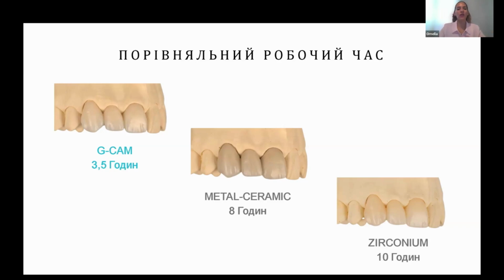We have to design. We are working in a monolithic way. This is going to help us go faster, but obviously zirconia needs hours of sintering process. We know that we need to put it in the oven and wait 3, 5, 6 hours, depending on the zirconia and also on the size of the prosthetic. And when we finish, we need to do the glazing and the staining process, also with a temperature process. So this is also going to take more time in the lab.